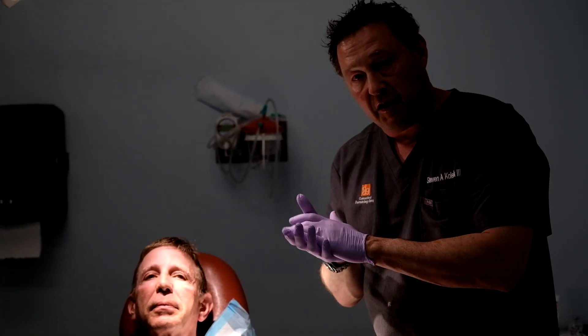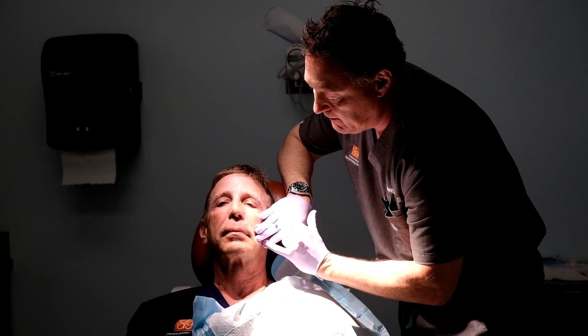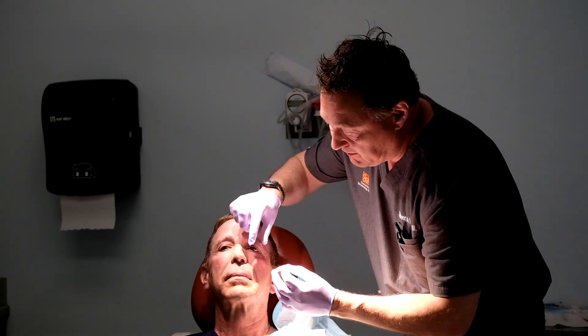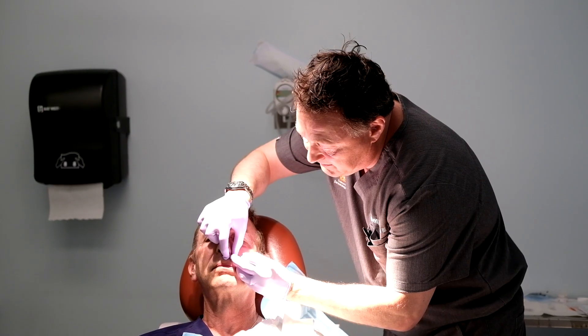The first thing we're going to do is numb up the area with a little injectable lidocaine. He'll just feel a little pinch here as we numb it up. And that will take a few seconds to take effect. It didn't hurt a bit.